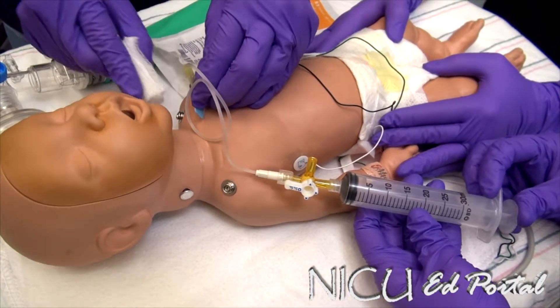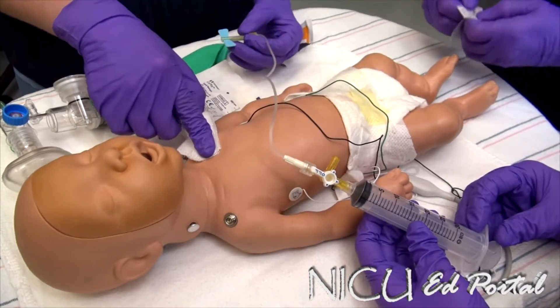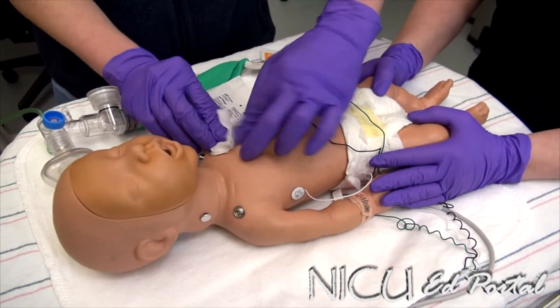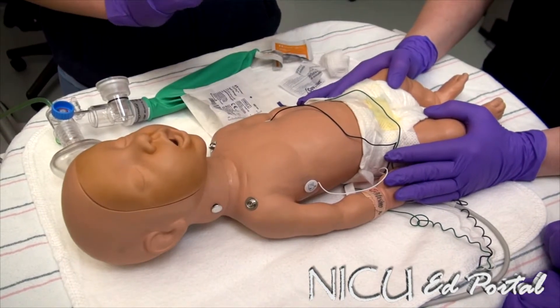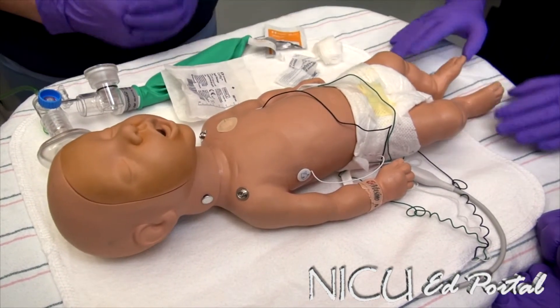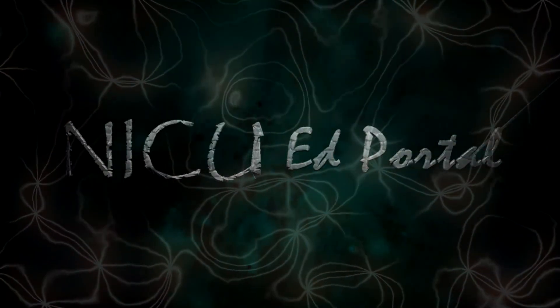Now we've evacuated the pneumothorax. We pull out the needle and cover it with gauze. Dispose of the needle appropriately — hand off the sharp and dispose of it — then cover the area with a bandage. Our vital signs have stabilized, and saturations are back in the normal range with normal heart rate and blood pressure.